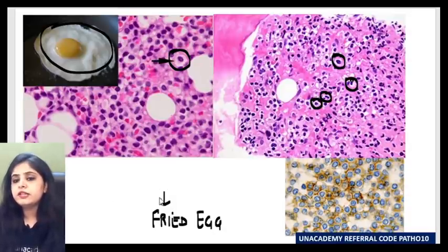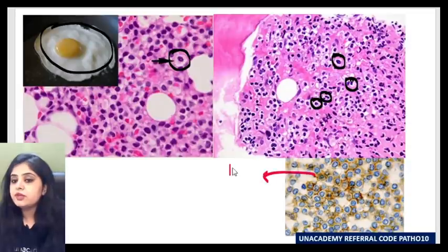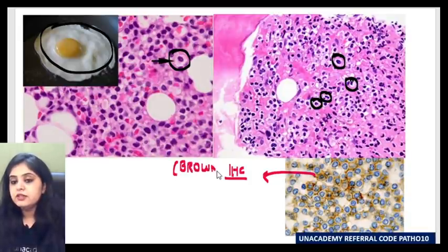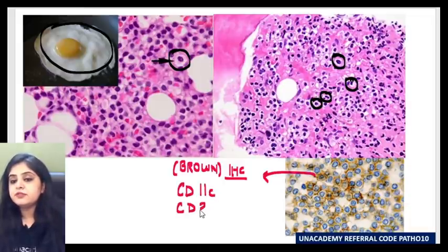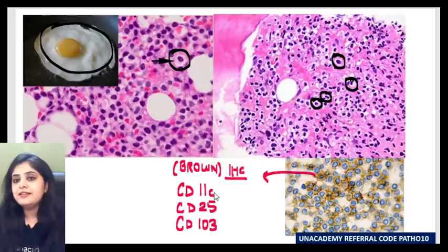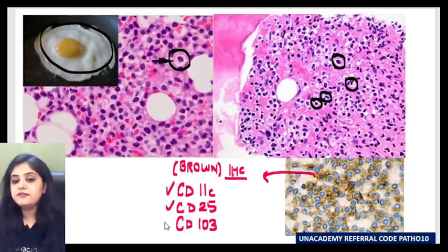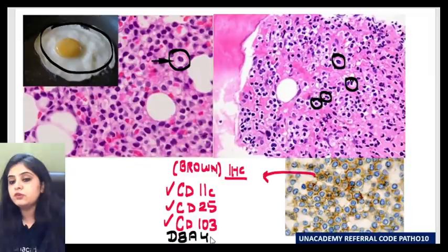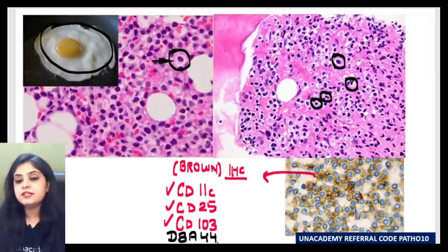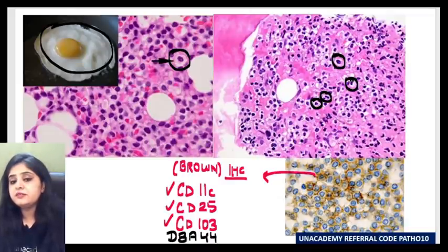What immunohistochemistry can be performed? You can see the brown color of IHC here. The stain can be positive for CD11c, CD25, and CD103 — one marker from each series: the tens, twenties, and hundreds. A newer marker that has also been identified for hairy cell leukemia is DBA44.